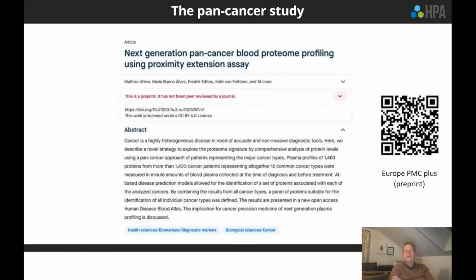A question that I had for you, as far as cancer, these particular samples were not pre-selected for stage, right? You just grabbed whatever 1,500 samples from a biobank. Can you tell me more about the stage of these cancers and whether or not it would bias the findings?